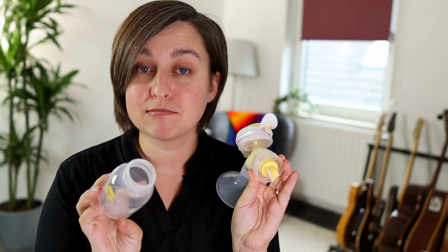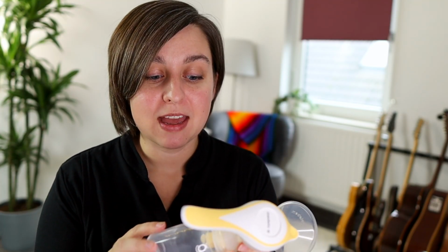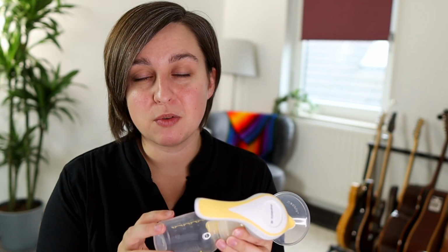If you go with a little pump like the Medela Freestyle Flex we just talked about, the cool thing is that these will all have interchangeable parts. So I would recommend a hand pump in the same brand that you have your regular pump so that all the bottles and everything is interchangeable. Then you don't have to buy 2 sets of parts. Lansinoh makes one, Spectra makes one, Avent, Philips, there's a few. I'll put some links down below for you, but highly, highly recommend a manual pump for you working moms.